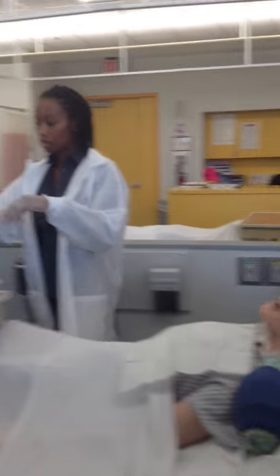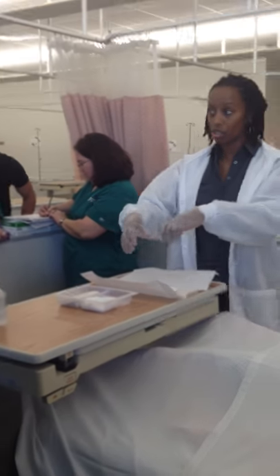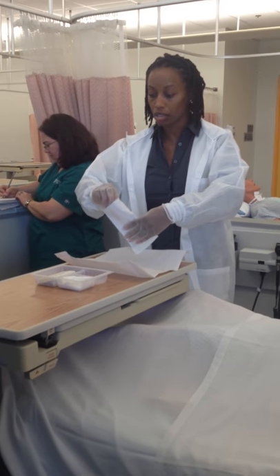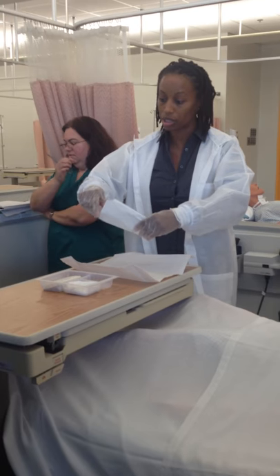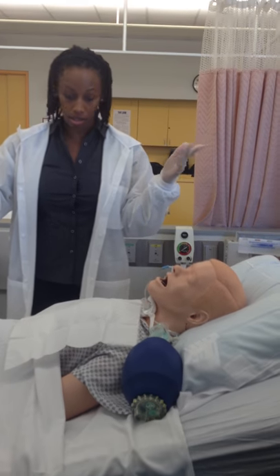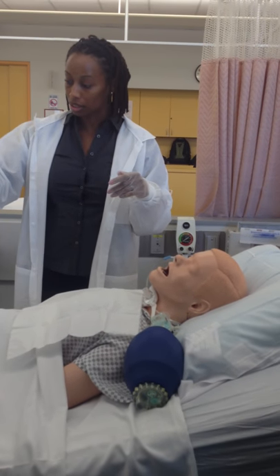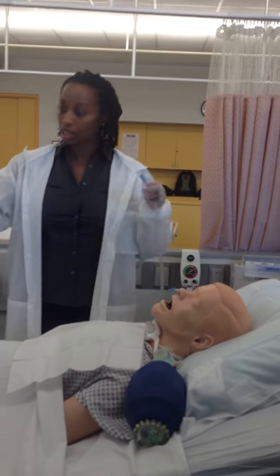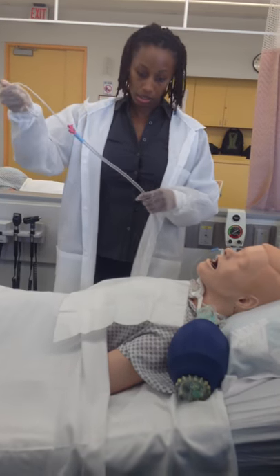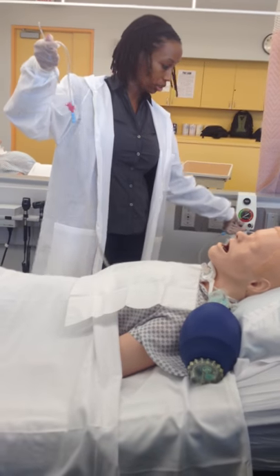The last thing you want to do is push bacteria or germs down into their trachea, which goes directly into their lungs. In the video, they have a dominant hand and a non-dominant hand. Your dominant hand you want to be sterile. I'm going to make my right hand my dominant hand — it's going to be sterile, and my left hand is non-sterile. I take the end of this — this is no longer sterile — and connect it to the end. This is sterile; this isn't. I turn my suction on.